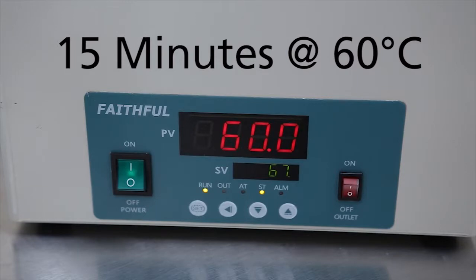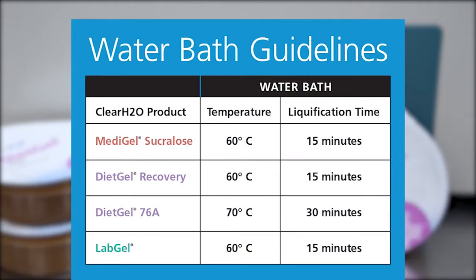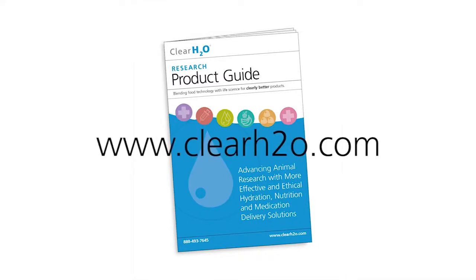After 15 minutes, MediGel Sucralose will be completely liquefied. Note that other thermoreversible gels may require the same or higher temperatures for the same or longer liquefaction times. Refer to the ClearH2O product guide and our website for thermoreversible mixing guidelines.